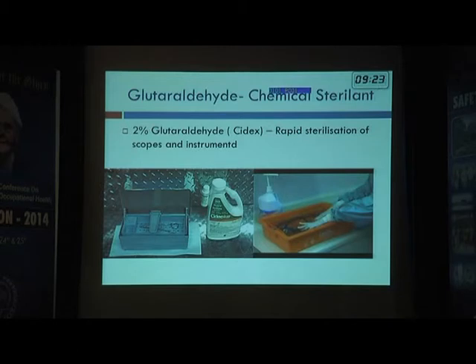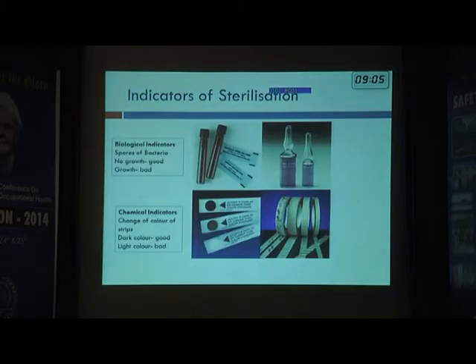So whenever you use disinfectants or any chemicals or any method for sterilization, always follow the label. So you soak it and then dry it before you use it on the next patient. So where your turnover is more, you can use this when compared to ethylene oxide sterilization. So how do you know whether your sterilization is working or not?